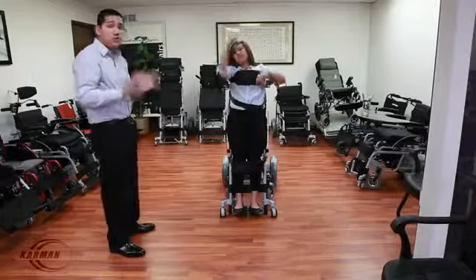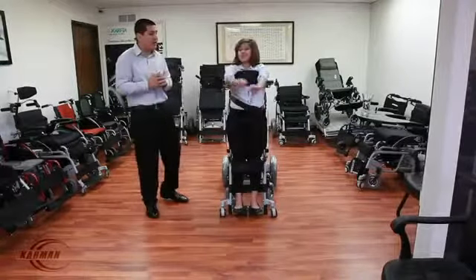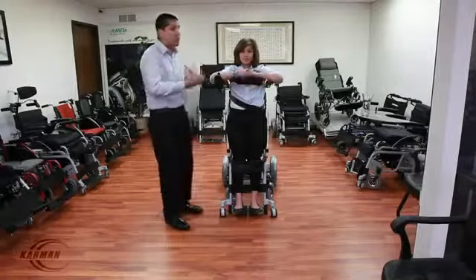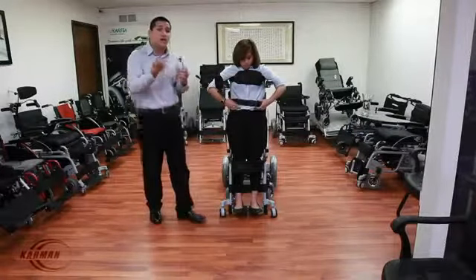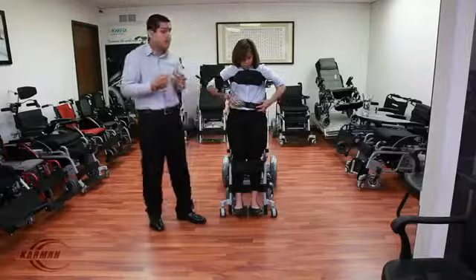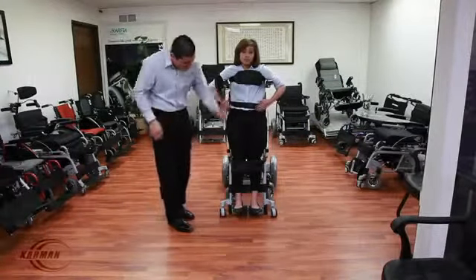Janice, why don't you go ahead and demonstrate that there is no way you can fall out of the chair. As I mentioned, the chest strap ensures that you are locked down and comfortable — this is a padded chest strap, with Velcro, very easy to adjust and very easy to remove for a loved one or caretaker. It has the lap seatbelt and the knee wedge.